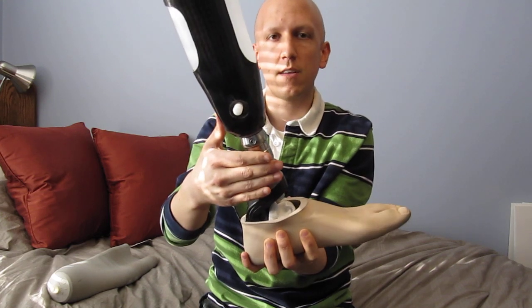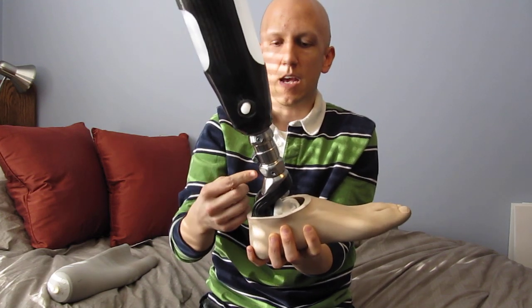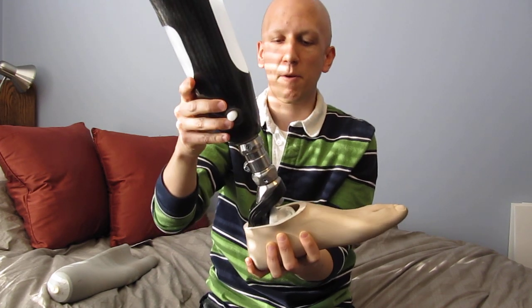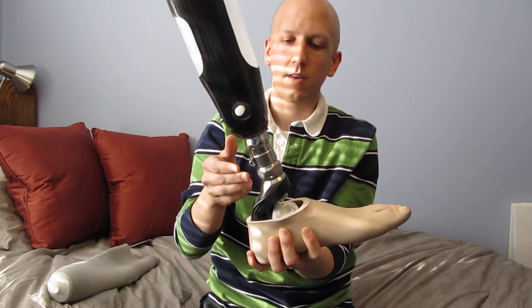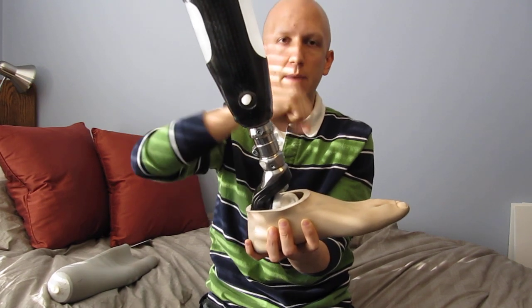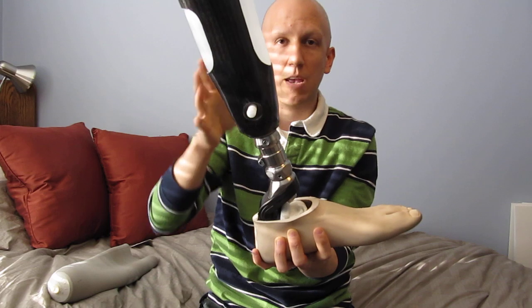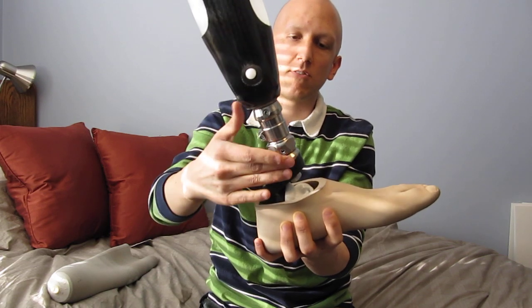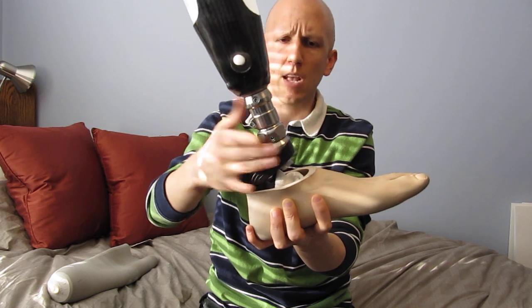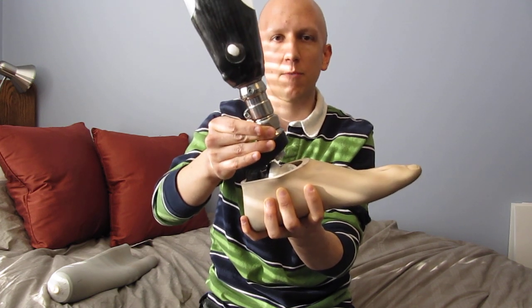Inside this joint is an inverted pyramid, and each of the four screws butt up against a side of the pyramid. So by screwing or unscrewing opposite screws, one can change the angle back and forth. All of the weight bearing is done through this massive piece of aluminum, not the screws, because the screws are more likely to fail.